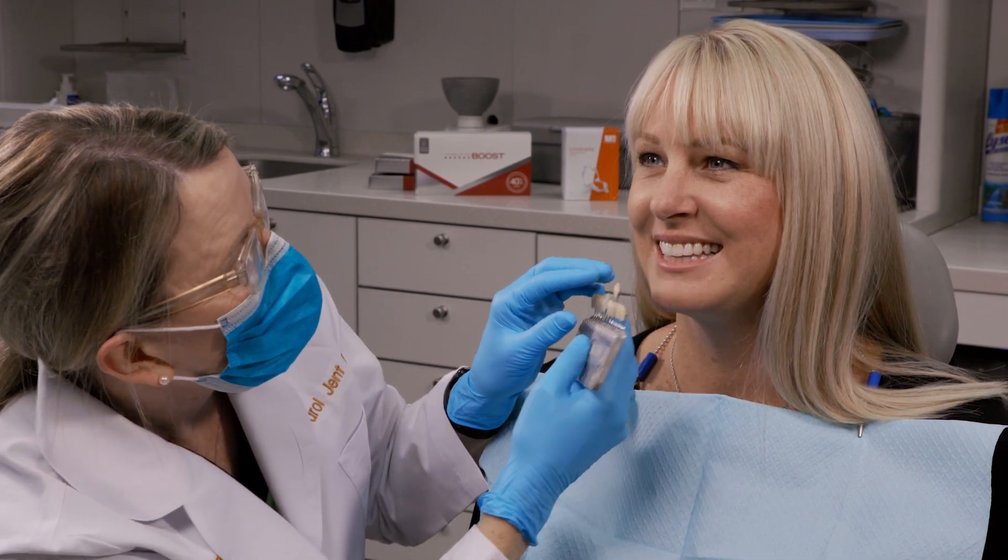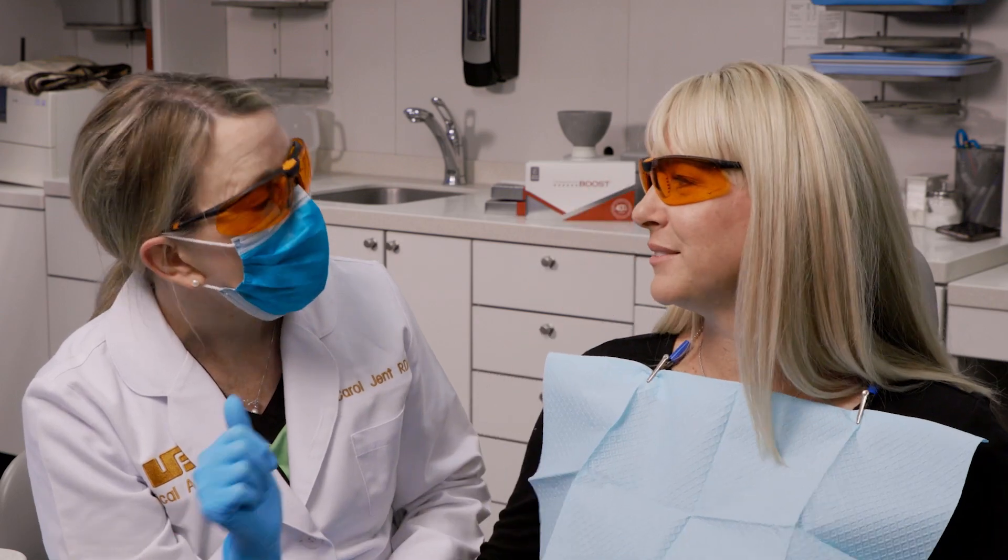Determine the patient's initial shade for your records. Both you and the patient should wear protective eyewear during the procedure.